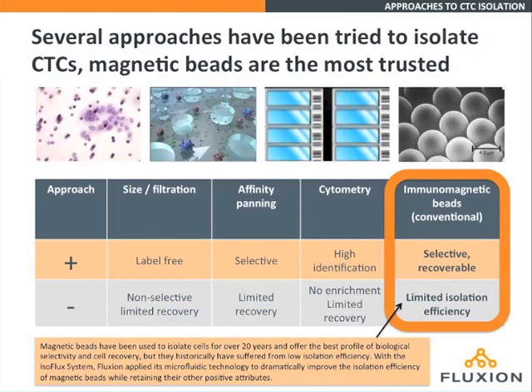While cells can be immobilized to a surface, the challenge there has been to elute the cell sample and have it available for further analysis. The elution process often leads to limited recovery and really large dead volumes in the sample. Again, cytometry has been another approach that's been used for really rare cells. That's been hard to implement successfully because of the large volumes needed and the fact that there is some cell loss in the process.